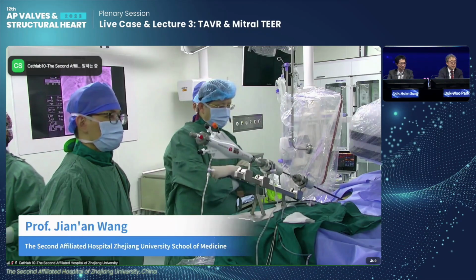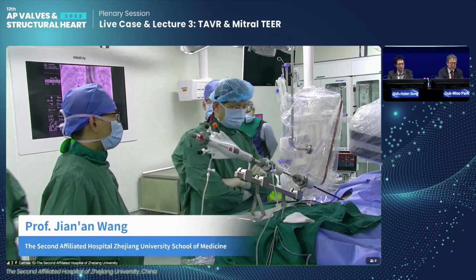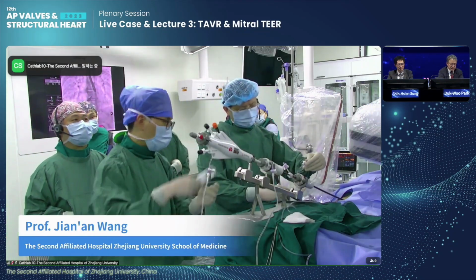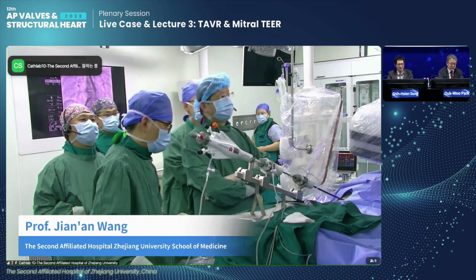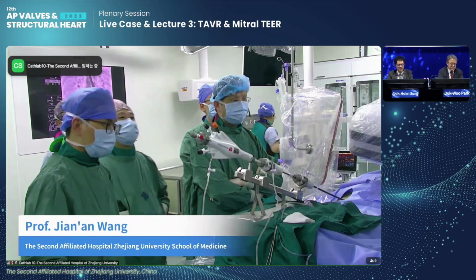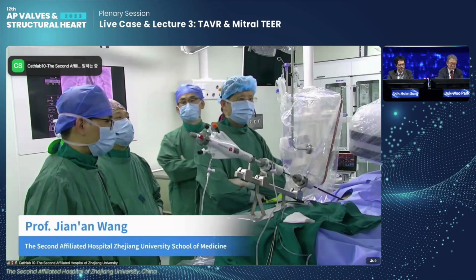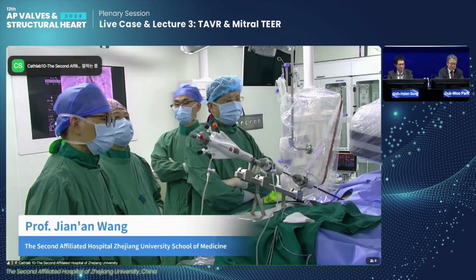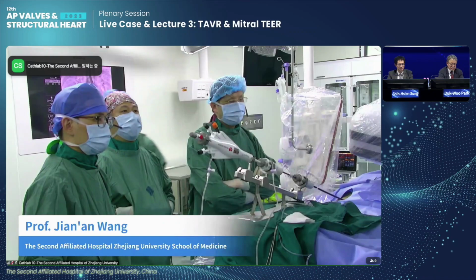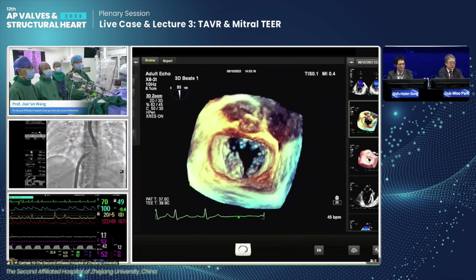Or can you show us the echo? Okay, yeah, we can see the TEE. Can you see the TEE right now? Okay. Yes. Okay, good.